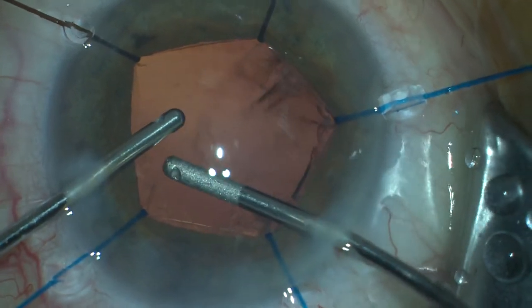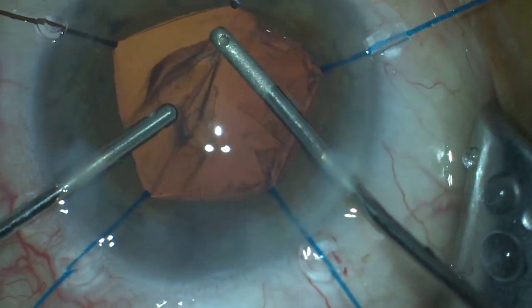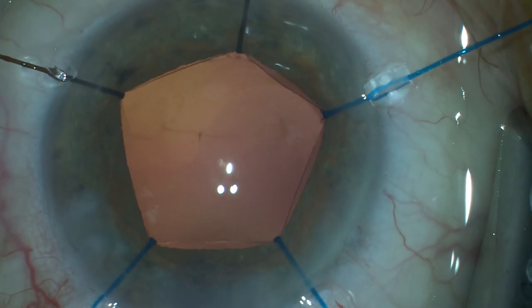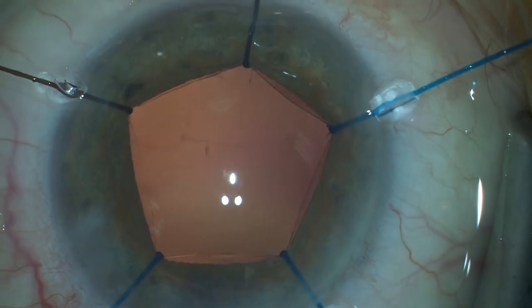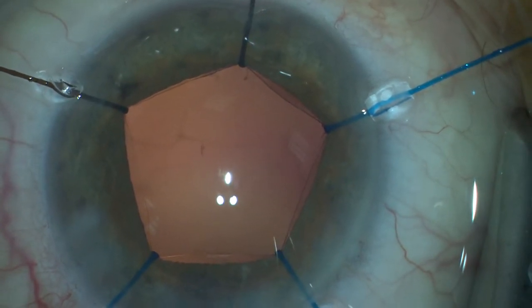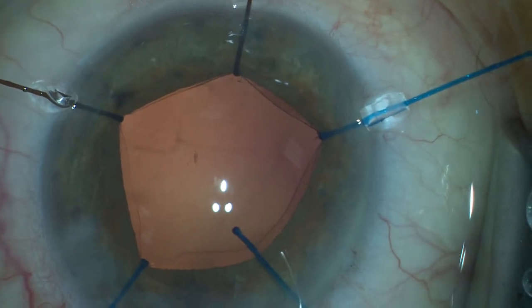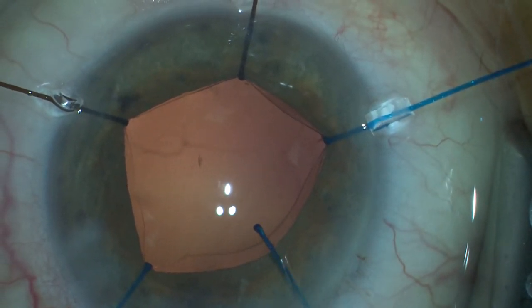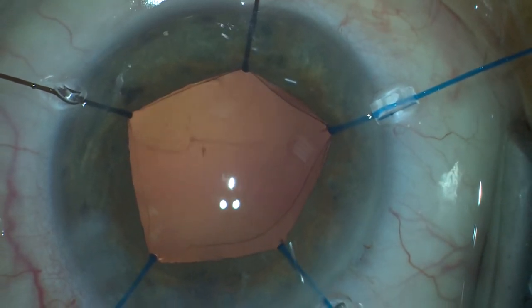You can notice here that the capsular bag does not float too much. It is stabilized very well with five iris hooks. This is better than four — it takes a little bit more time, but it is safer.